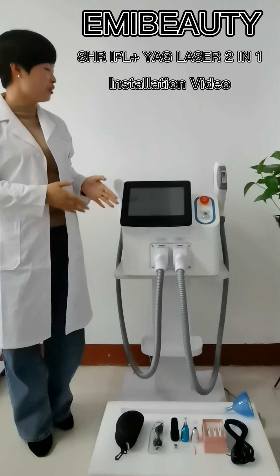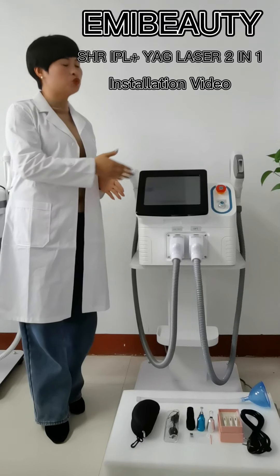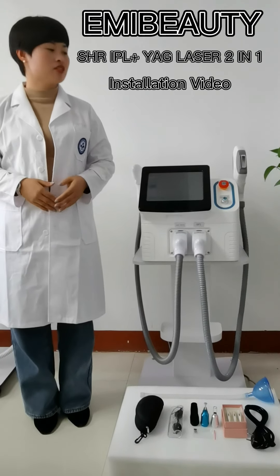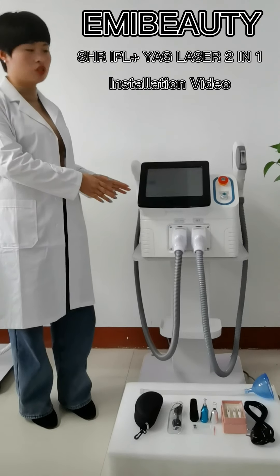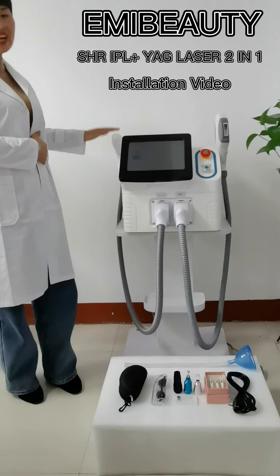Hi, this is our newest IPL-SHR Yag Laser 2-in-1 Multifunctional Beauty Machine. When you receive the machine, first you will receive the host, two handpieces: one IPL-SHR handpiece and one Yag Laser handpiece.